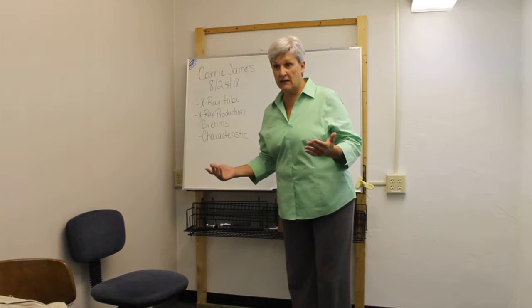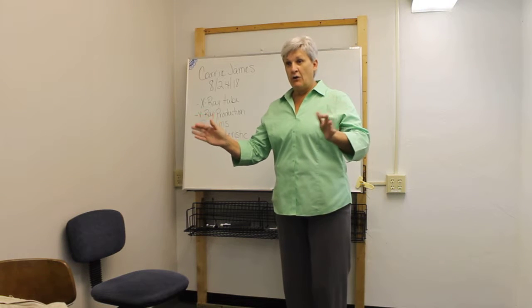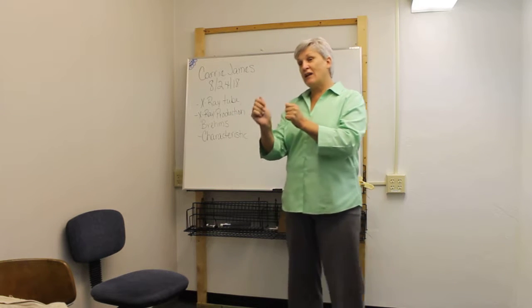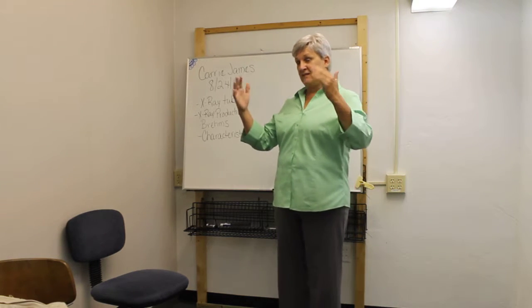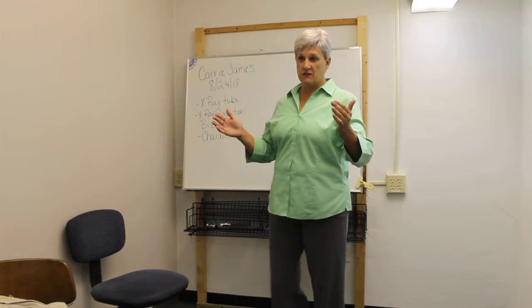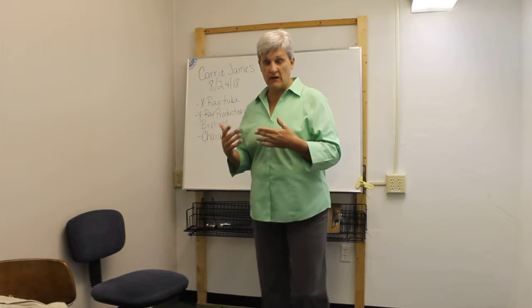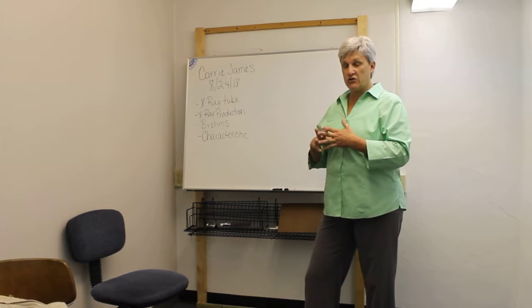Same principle with magnets. You put two like poles together, what happens? They repel. But with the magnet, if you put the opposites together, they attract. So that is an essential element when it comes to the X-ray tube and X-ray production. Without that potential difference between positive and negative, the electrons are not going to cross over to interact with the anode. And the anode is made of tungsten. Tungsten's a very heavy metal, has a high melting point, and we use that for X-ray production.